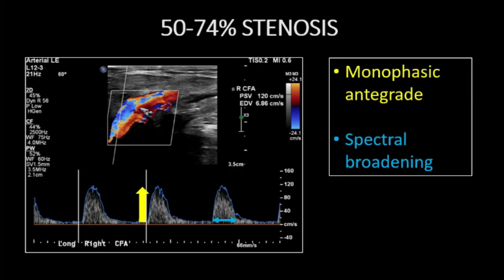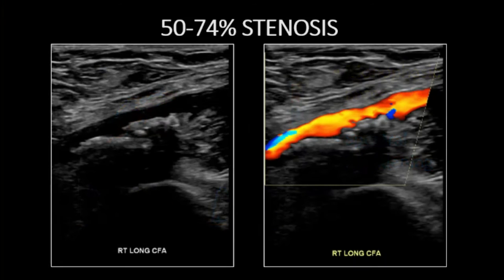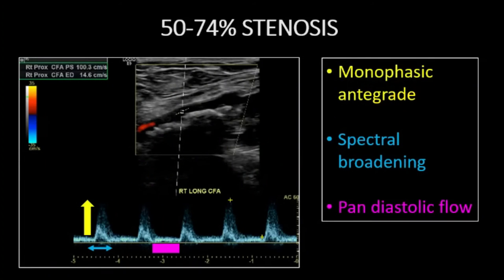In another example of greater than 50% stenotic disease, again we see a monophasic flow pattern with turbulent flow manifesting as spectral broadening. Pandiastolic flow is present. The systolic upstroke remains sharp. There is loss of the early diastolic flow reversal. Grayscale and color doppler confirm at least 50% stenosis or greater.